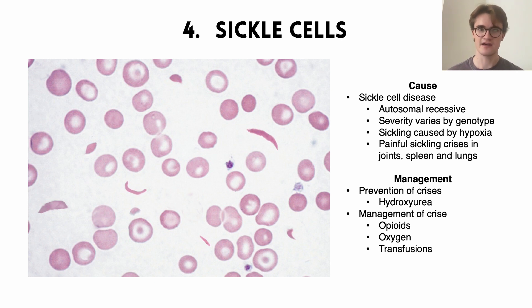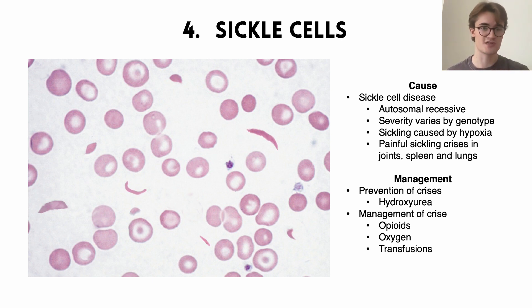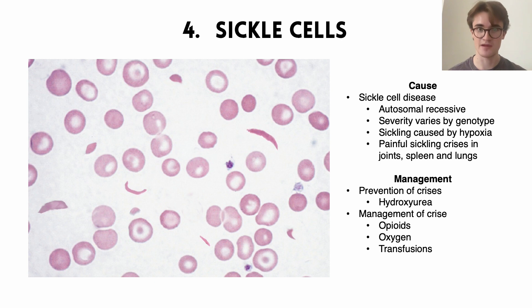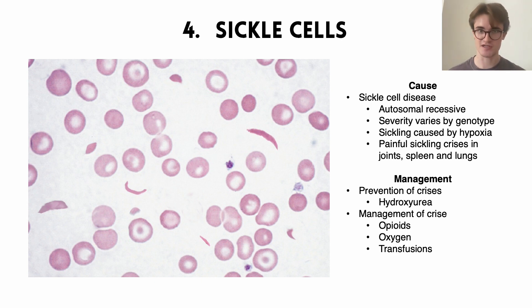The fourth blood smear to know is sickle cells. Looking at this blood smear we see lots of normal circular red blood cells with a pale center, and interspersed throughout are abnormal sickle cells — almost like fragments, crescent-shaped or sickle-shaped. These are caused by sickle cell disease, a genetic autosomal recessive disease. You need to inherit two faulty copies of the sickle cell hemoglobin allele to be really affected. People who are heterozygous — one faulty, one normal allele — are mainly unaffected, so severity varies by genotype.